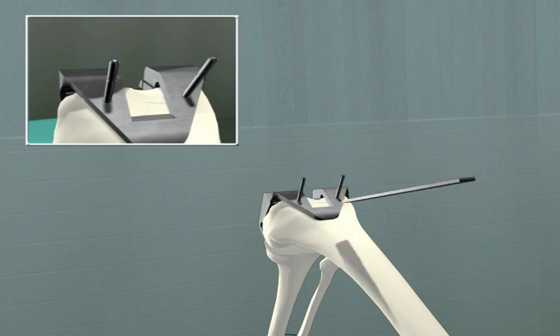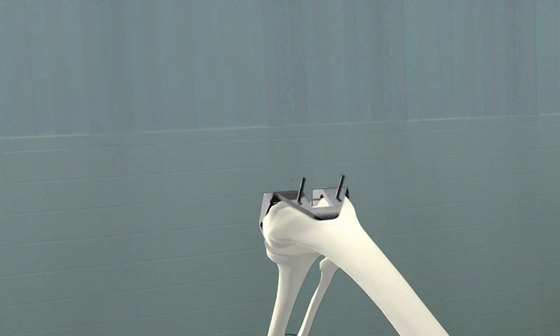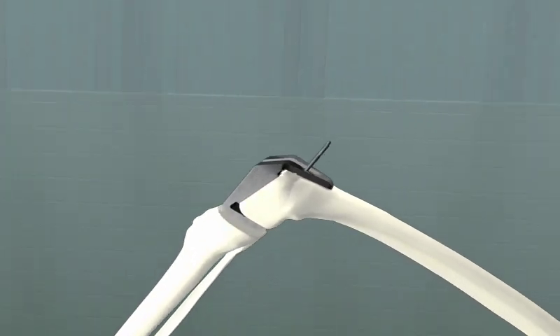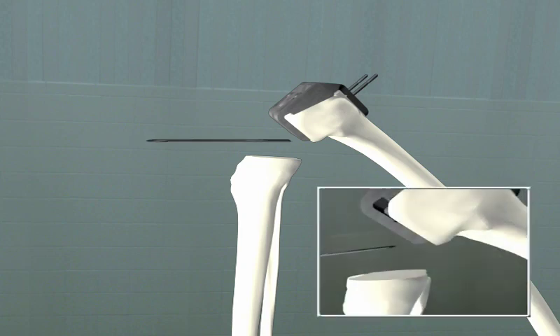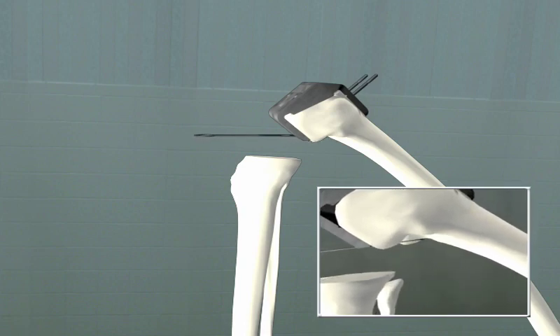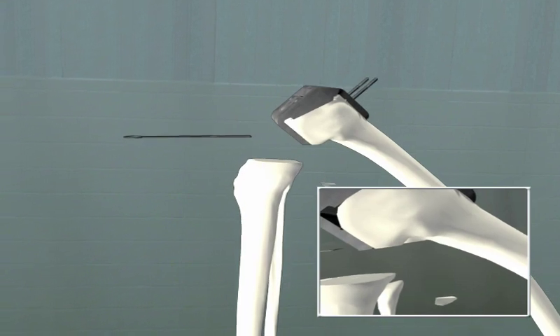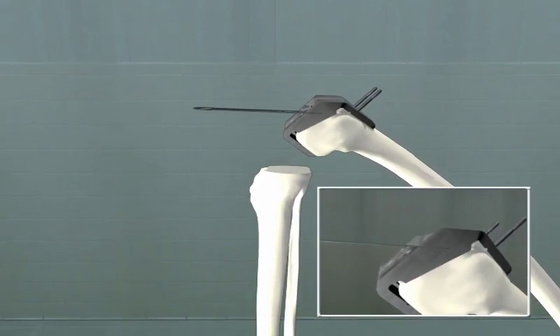The bone is then removed using an osteotome from either the inferior or superior surface. The posterior condylar cut can then be made with a power saw or osteotome, making sure to remove the posterior bony contents that will prevent impingement into the bearing surfaces. The anterior chamfer cut and the posterior chamfer cuts then can be made also with a power saw through their respective slots.